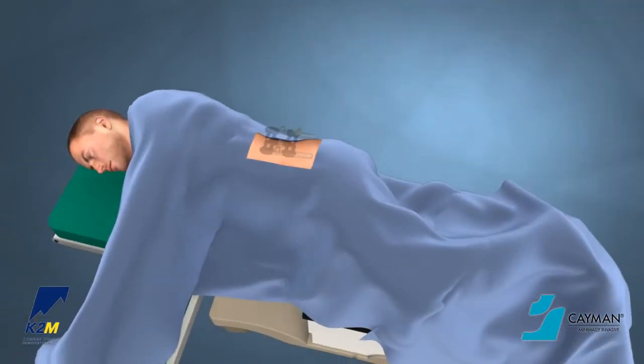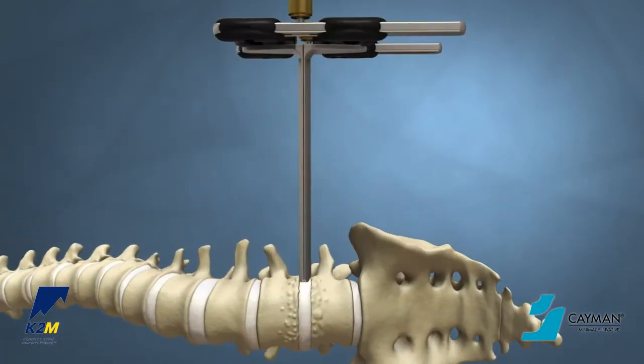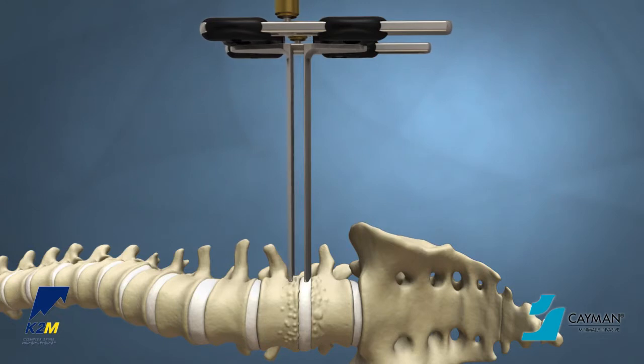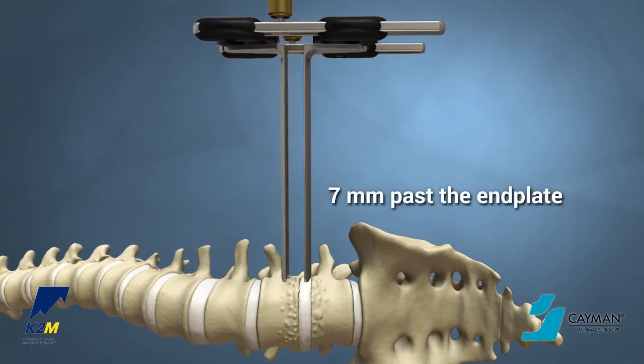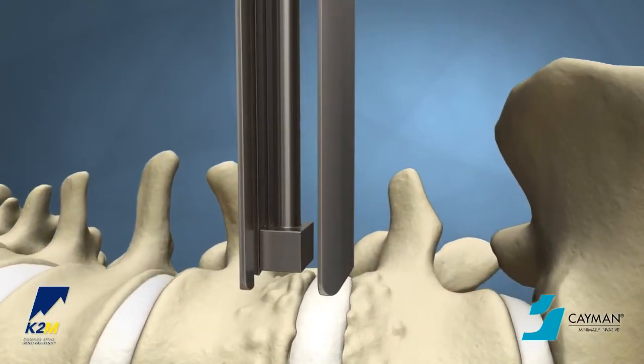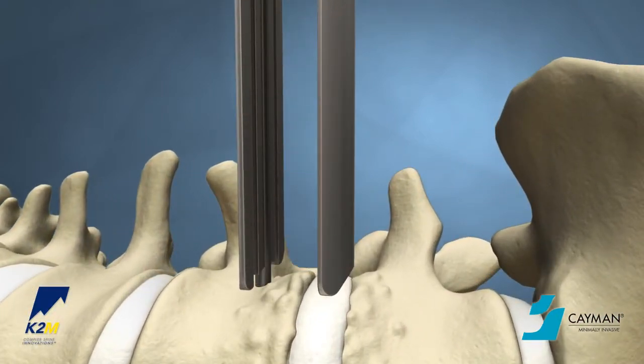Place the patient in a lateral decubitus position to begin the Ravine procedure. In order to streamline the Cayman MI procedure, it is important to note that the retractor blades should be initially placed 7 mm past the end plates. An offset guide can be used to ensure adequate space for the plate.